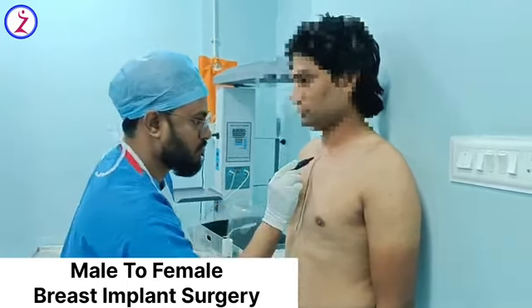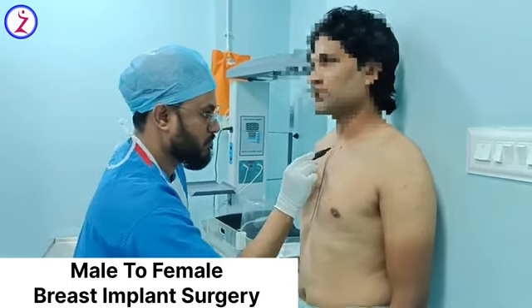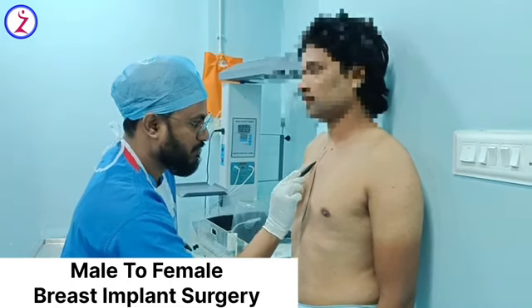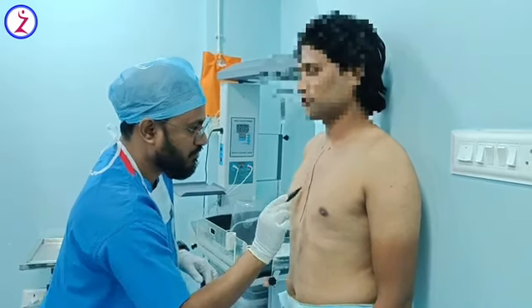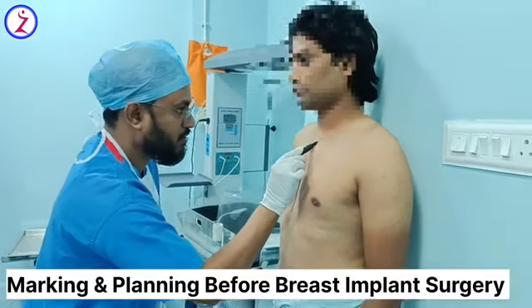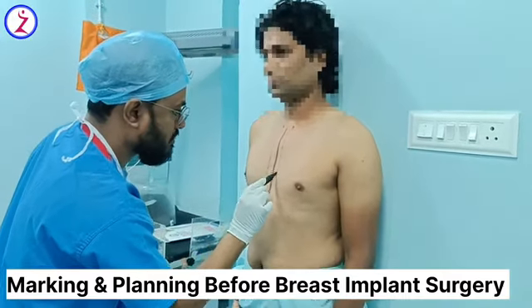In many patients who have already started hormone therapy, they may develop a little bit of breast gland. In this particular patient, not much breast development has happened, though she's on hormone therapy. But still we are now planning for breast augmentation using breast implants.